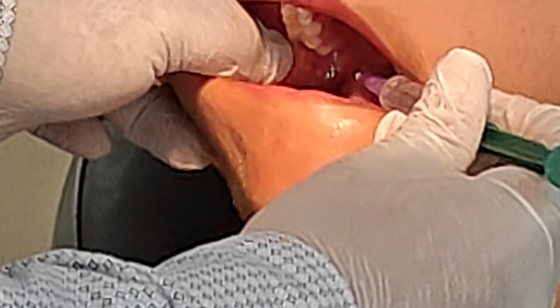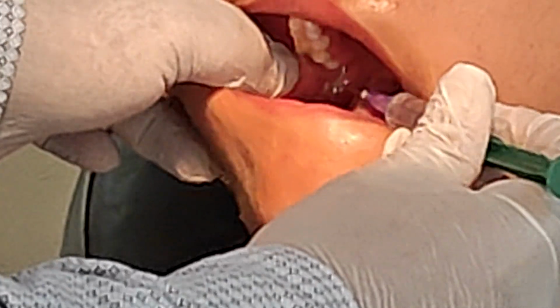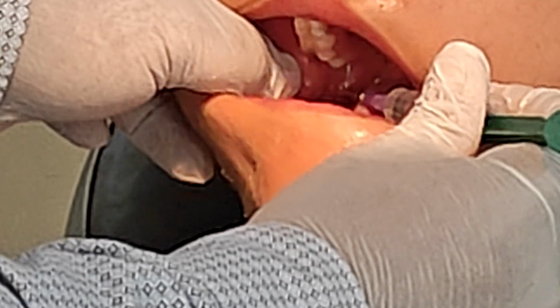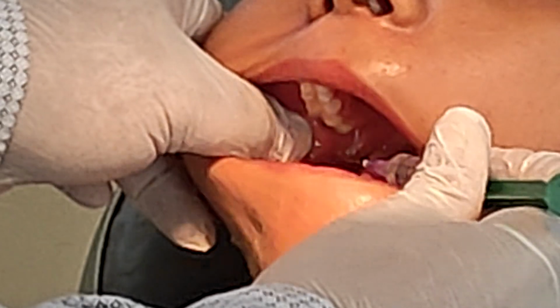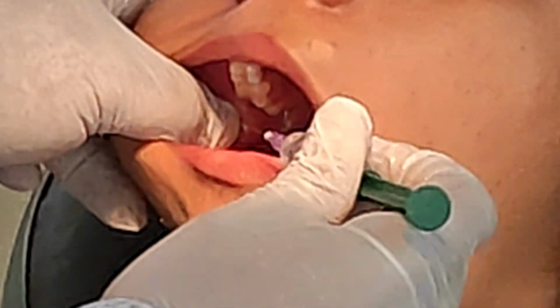The syringe should come from the opposite arch at the premolar, intersecting between the first and second premolar. So keep the thumb of your non-working hand in such a way that it corresponds to the pterygomandibular raphe and the coronoid notch, and the thumb will determine the height of the needle insertion.